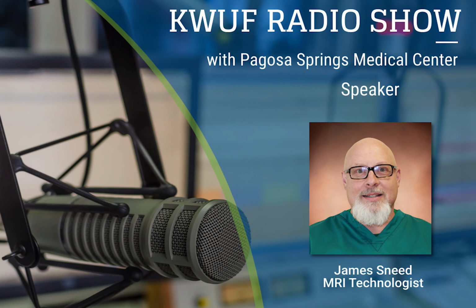But you can expect a scan to last, like I said, 30 minutes, 60 minutes, or even up to 2 hours. And the best thing patients can do is wear clothes that are metal-free, zipper-free, and bras without clips or slides, so sports bras work very well. We like stretchy pants, t-shirts, pajamas, and workout clothes that have no metal. But if you come here after work or you need to change, we have gowns and shorts available that we can put you in.